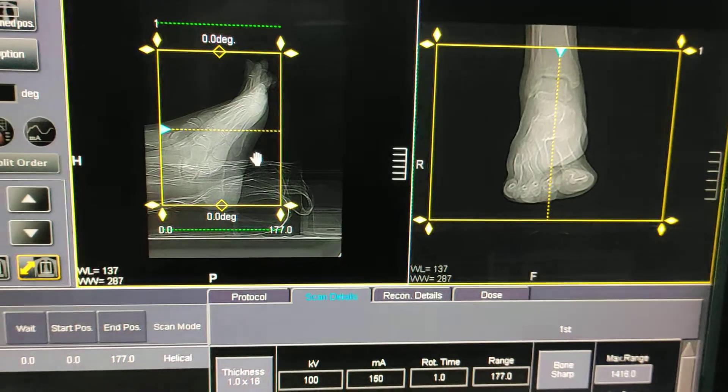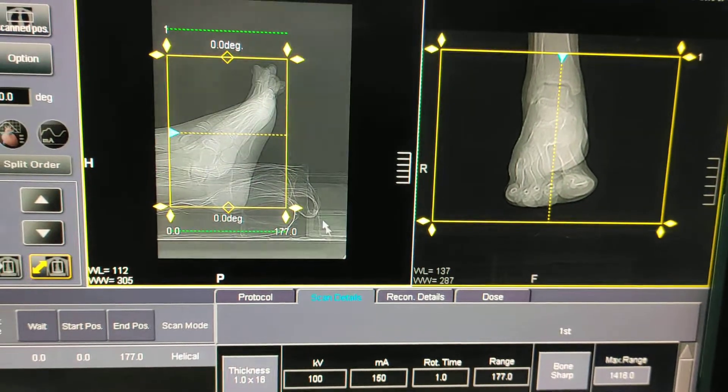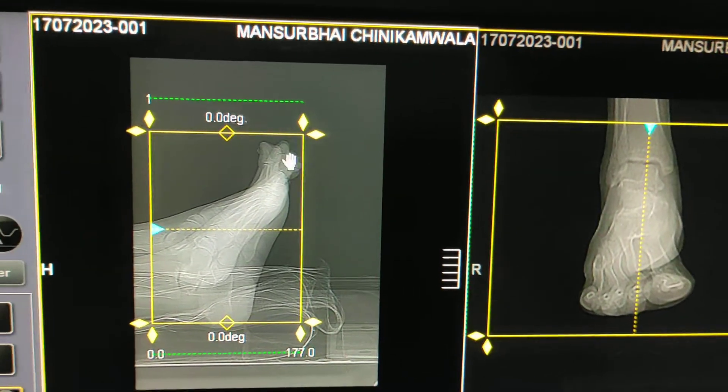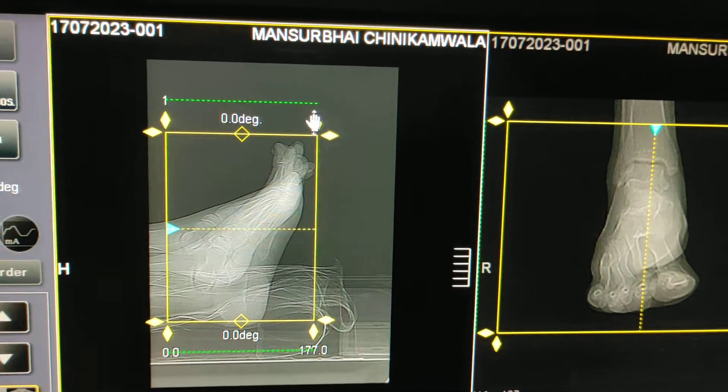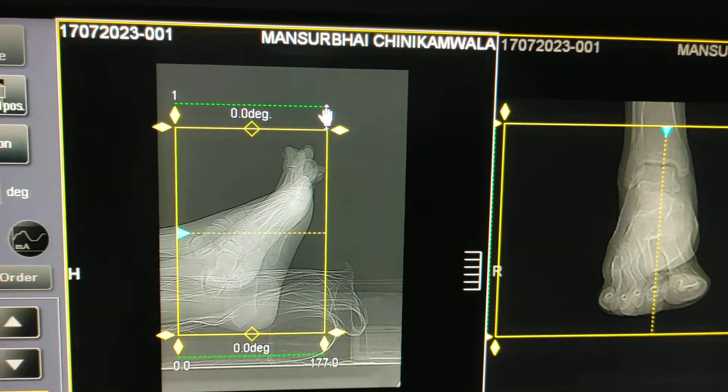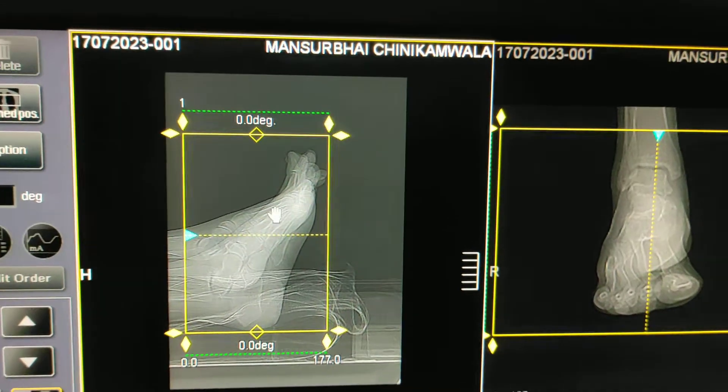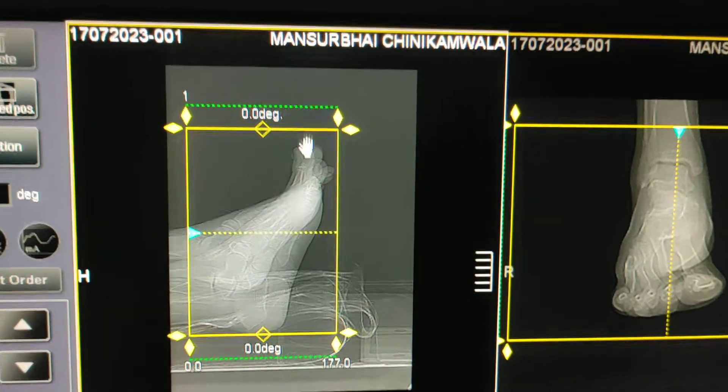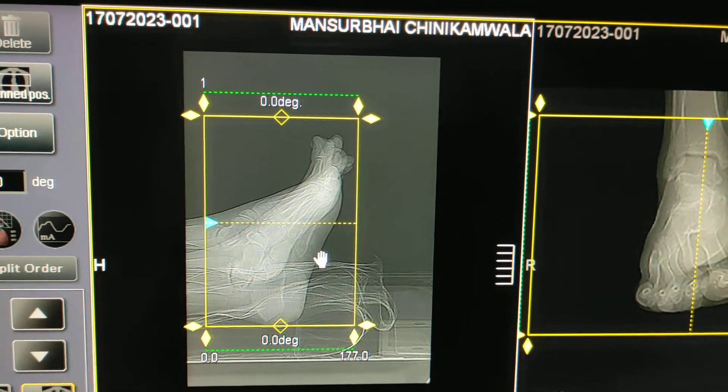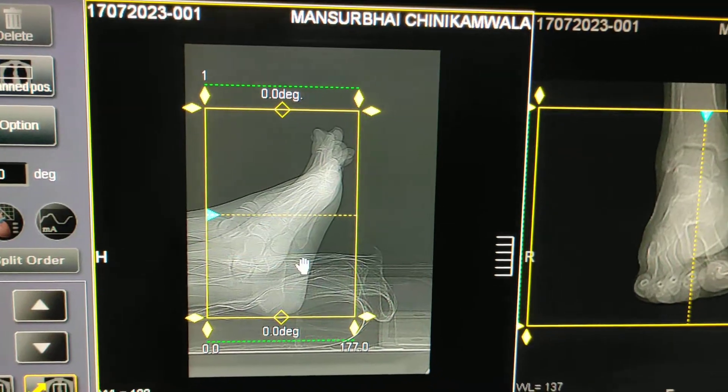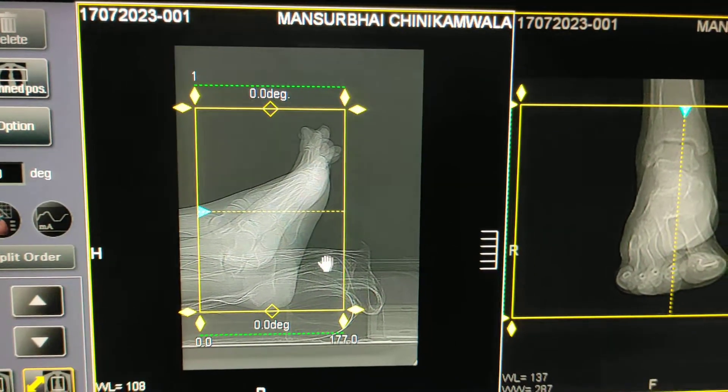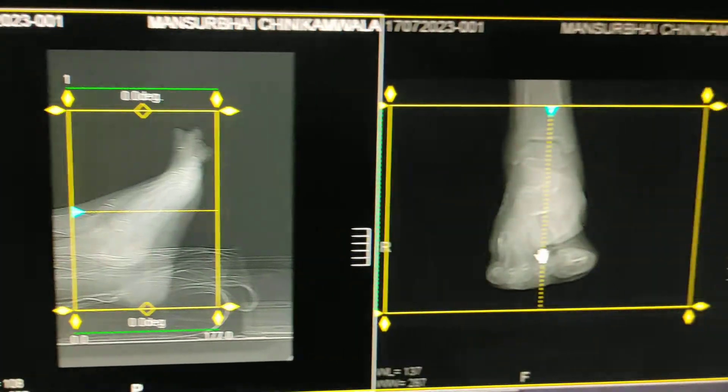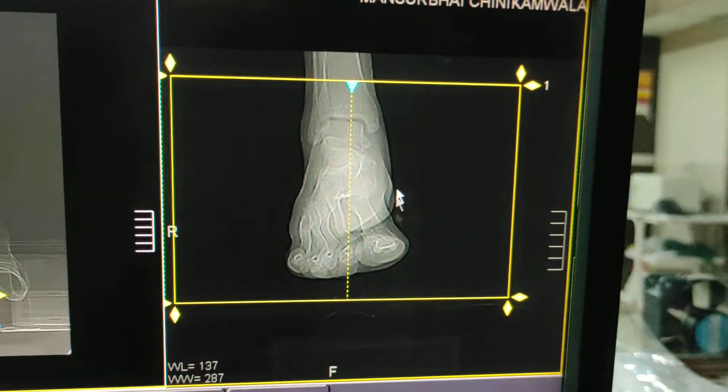Now you have to correlate that the field of view should be correct before starting the scan. The FOV is also correct in this lateral and this is AP.